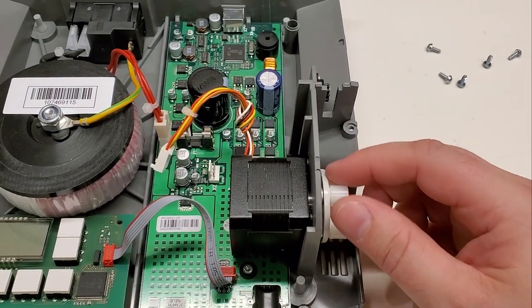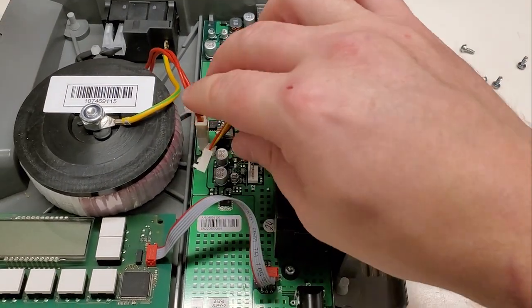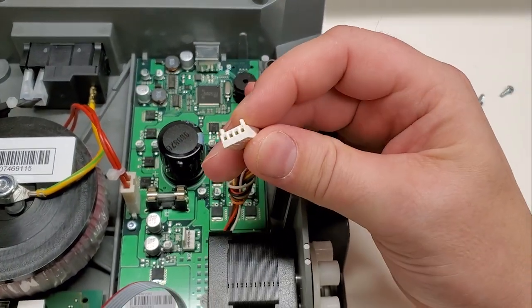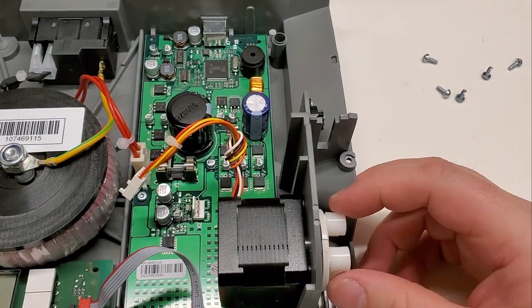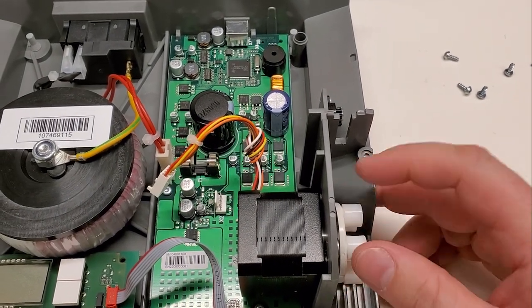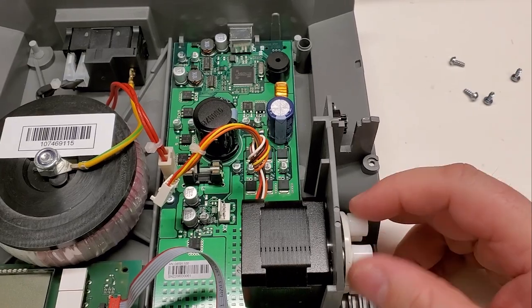It's a permanent magnet motor, so as you spin it, if I were to have my multimeter connected to these ports right here, you would see that I'm actually kicking out DC voltage. And you can kick out a considerable amount of voltage by spinning this guy.